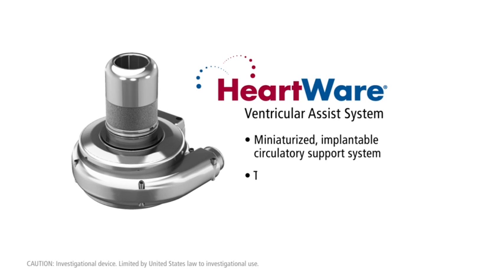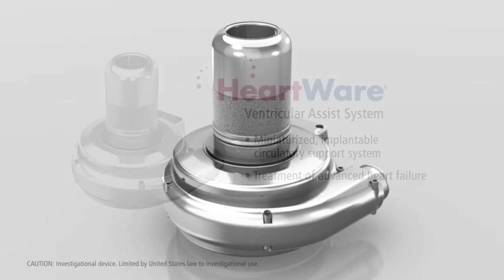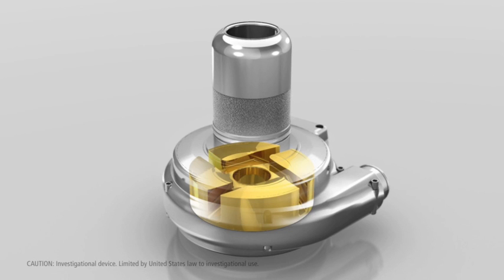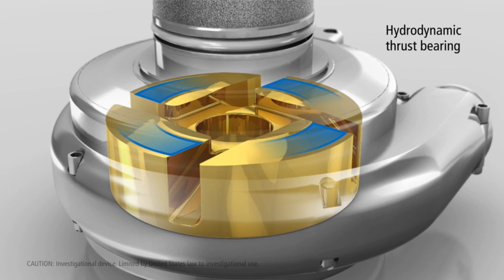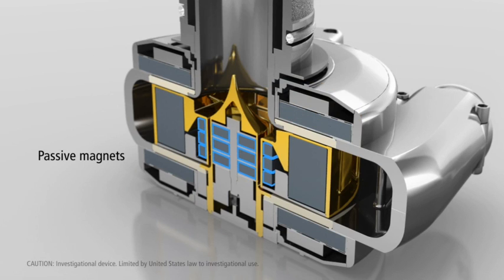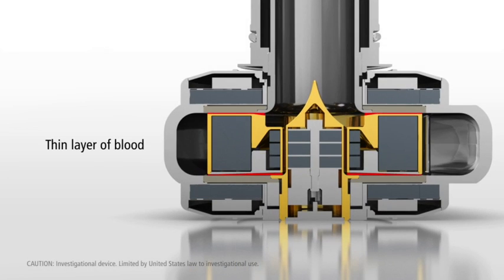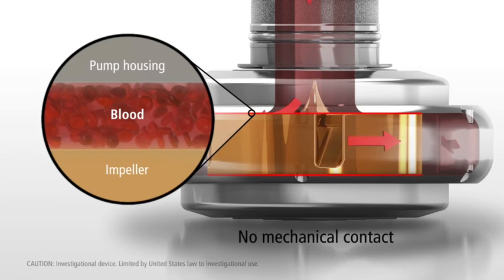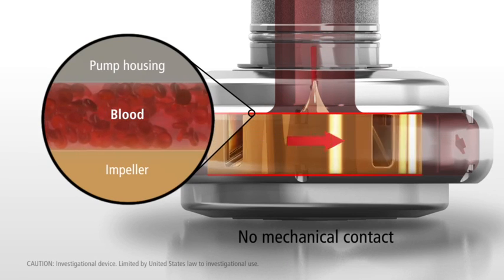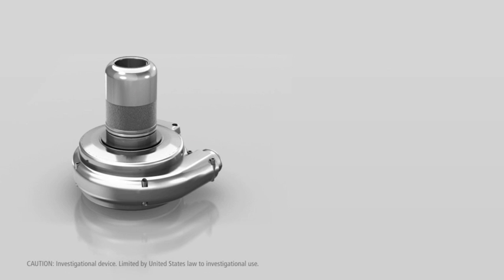The HeartWare Ventricular Assist System is a miniaturized implantable circulatory support system for the treatment of advanced heart failure. At the core of the HeartWare platform is a proprietary suspension system for the wide-bladed impeller. Using a combination of both hydrodynamic and passive magnetic forces, a thin layer of blood is established between the impeller and the pump housing.